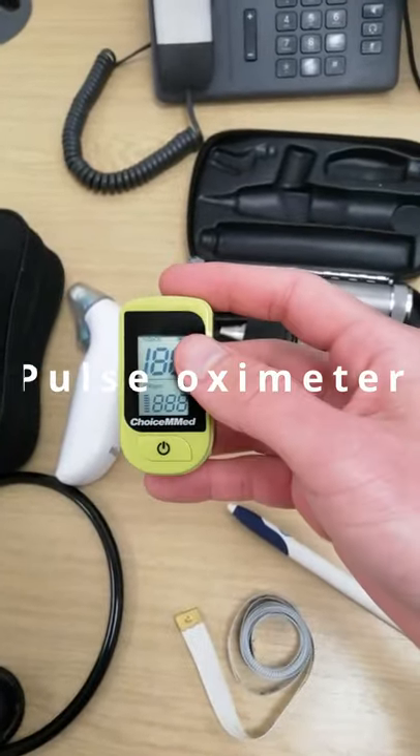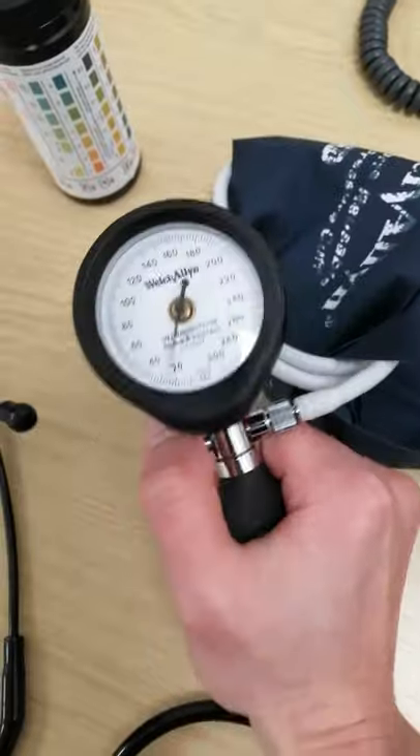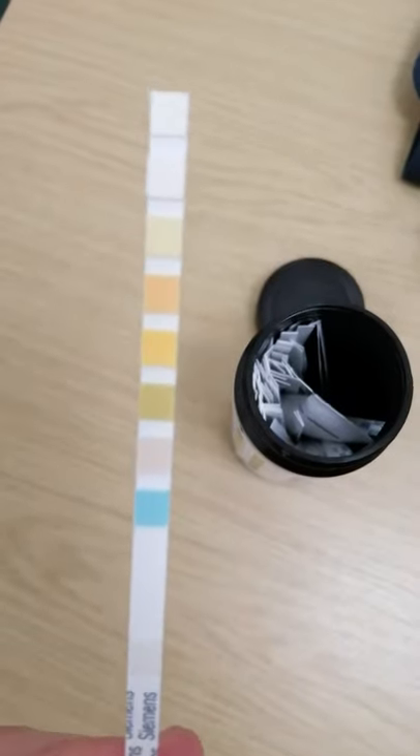Pulse oximeter — this device enables me to check the patient's pulse and oxygen saturation. This is a sphygmomanometer to measure blood pressure. This is a urine dipstick to help diagnose urinary tract infection.